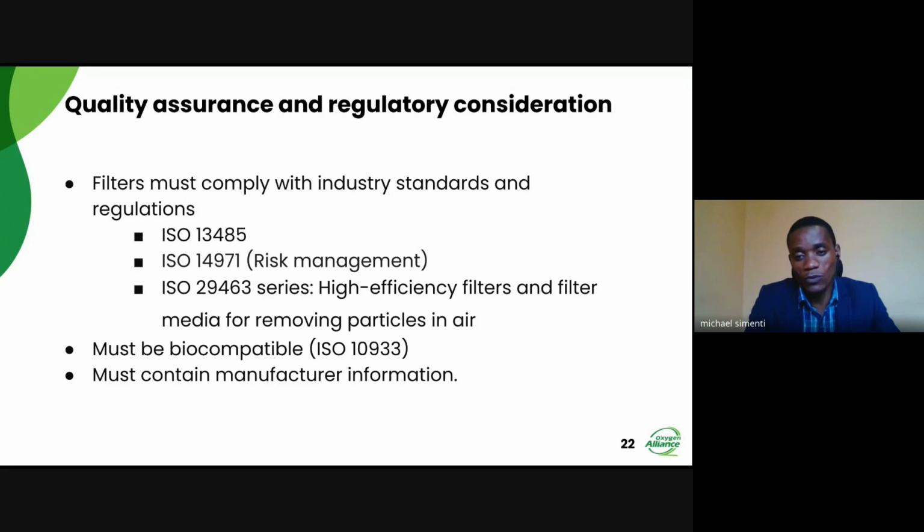So there are different standards. That's why the first point we are saying is that we must make sure that these filters comply with industry standards and regulations. We have ISO 13485, which talks about medical devices and how you should use them. There is also ISO 14971. This one is about risk management. We have talked about how, if we are not properly handling these filters, we are putting the lives of patients at risk. Yet if we follow this standard, it will tell you how best to keep your devices and these filters, so that the life of the patient is safe.